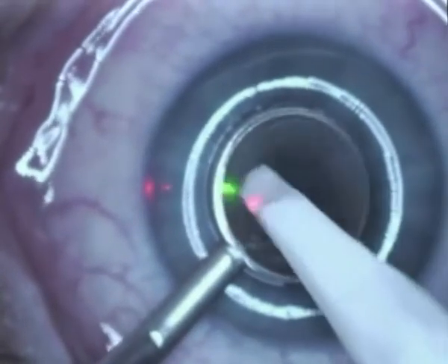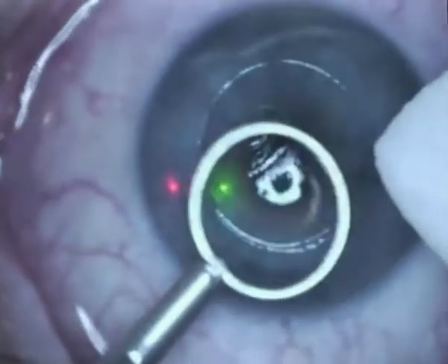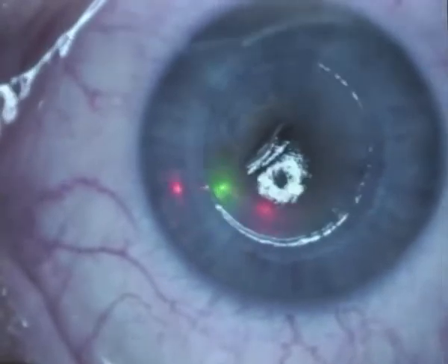Alcohol, of course, is very highly toxic to cells. There's a possibility it might have an apoptotic effect on the anterostromal keratocytes, which possibly prevents haze.